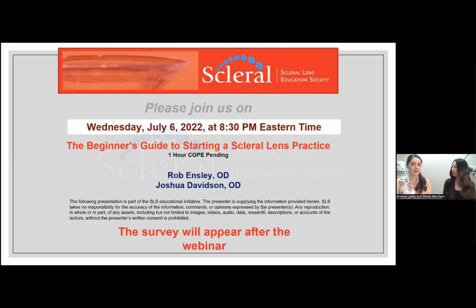Yeah, same. I will usually tell the patient, okay, here's what we're going to do. We're going to do your distance absolutely first. Here's a pair of readers to get you through, but I want to see what your best vision possible is. And let's say they're 20/20, 20/25, then I'll be more open to doing a multifocal with them. Any patient less than 20/25, I really want them to maximize their vision, and we will do glasses over the top. But if they're happy with the 20/20 and still want to give the multifocal a try, no problem.